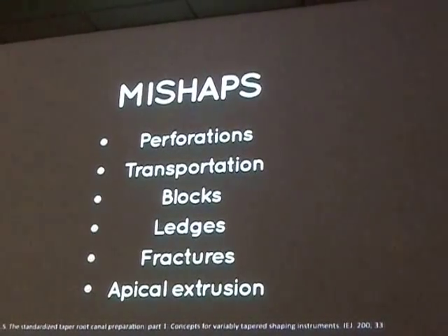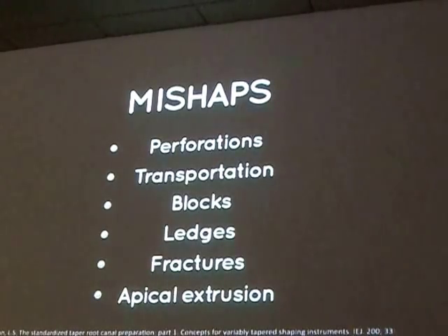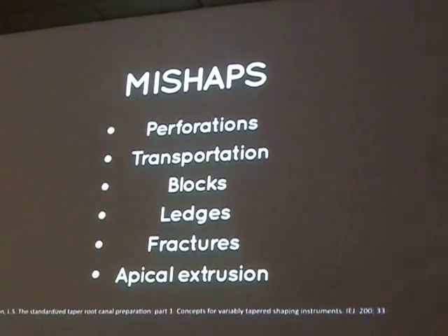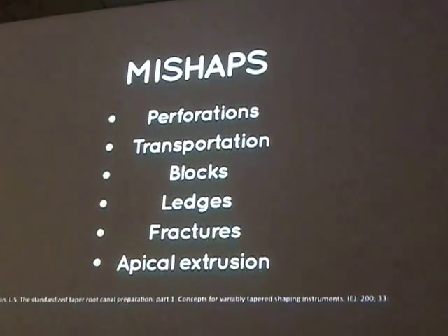So what about mishaps? We have perforations, transportations, blocks, ledges, fractures, apical extrusion. All of these things perhaps are more likely to occur as we are increasing our file size.